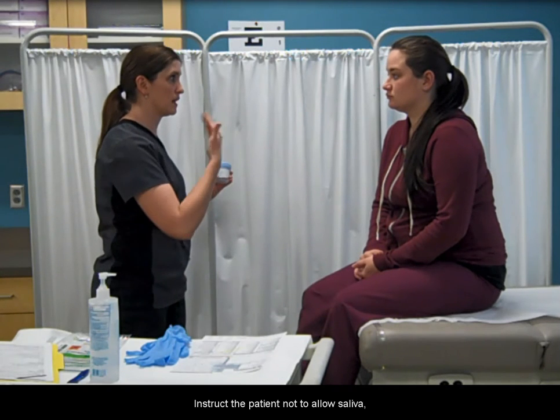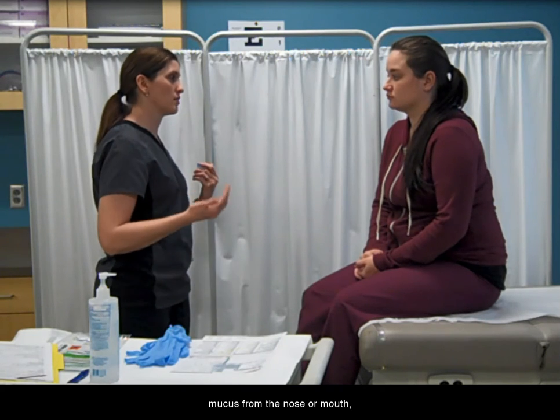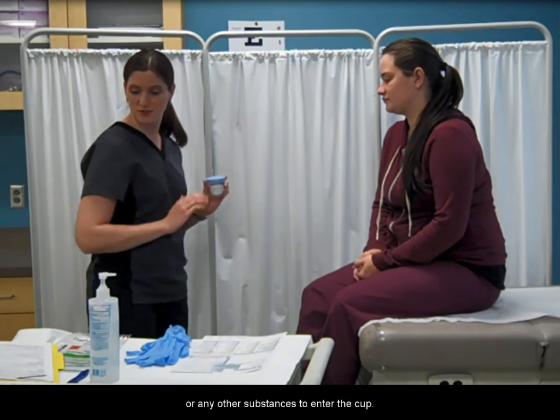Instruct the patient not to allow saliva, tears, sweat, mucus from the nose or mouth, or any other substances to enter the cup.